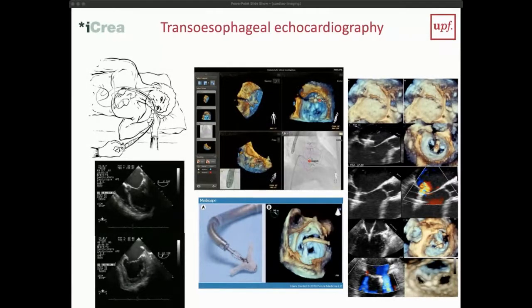Of course, the big disadvantage is that you have to swallow this tube. Whoever got a gastroscopy, for example, or a transoesophageal ultrasound, knows this is definitely not comfortable. Plus, the esophagus, although it looks like a simple organ, can cause a lot of trouble.